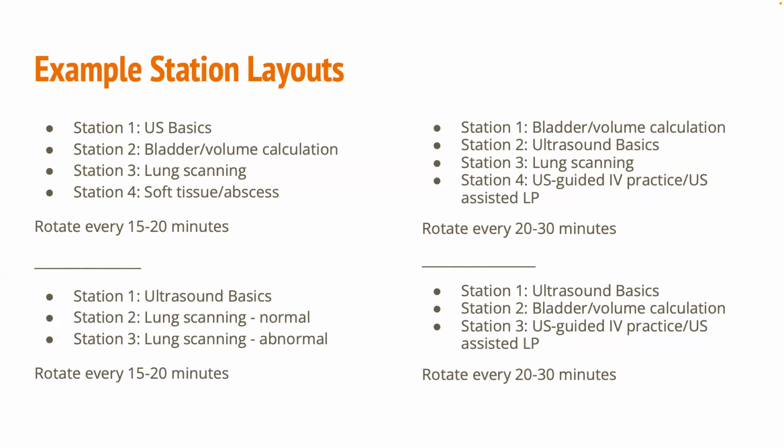So this is a nice way for people to understand how an ultrasound probe views an image, or how it's cut, and have them try to mimic or repeat an image that we have already created. So that has gone over fairly well in all of the workshops that I've done so far. And then you can scale up or down in terms of how much abnormal you want to include versus just normal. And this is not exhaustive, by the way. There are so many other ways that you can do this.